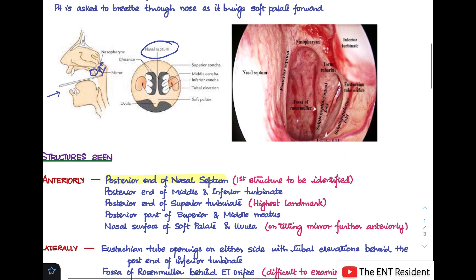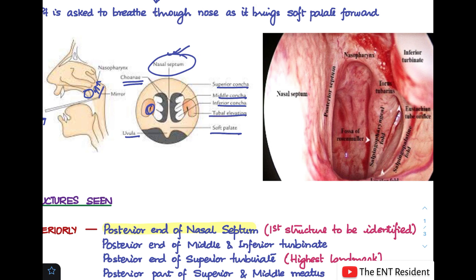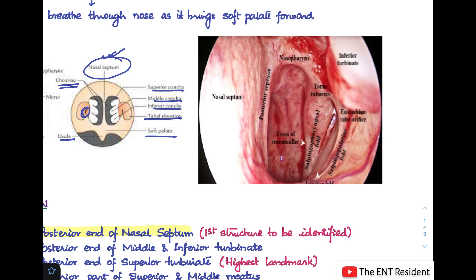Looking at this picture showing the normal posterior rhinoscopy view: midline you see the nasal septum, the two choanae on both sides, the uvula and soft palate, and the superior, middle, and inferior turbinates. Laterally you see the Eustachian tube orifice, the tubal elevation, and the fossa of Rosenmuller behind it. This endoscopic picture of the nasopharynx shows the posterior end of the septum, the Eustachian tube orifice, and behind it the fossa of Rosenmuller.